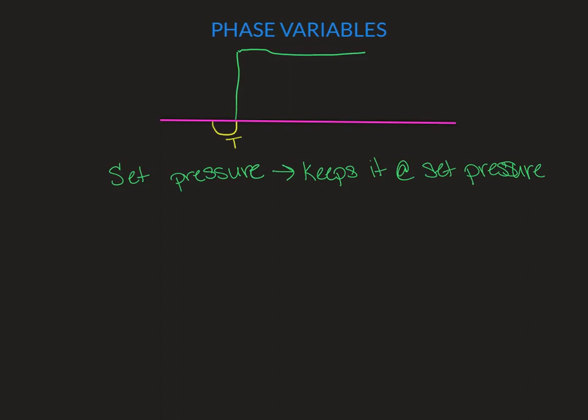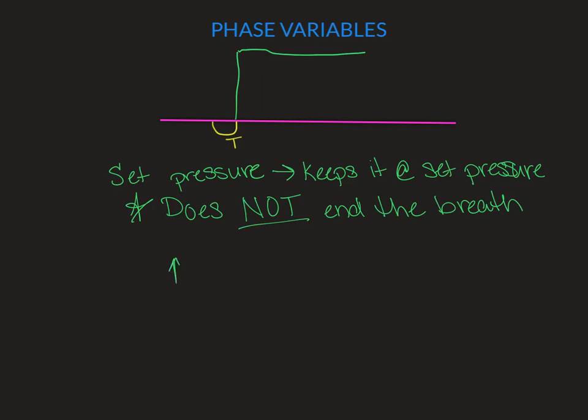It's really important to remember that the limit that you set does not end the breath. This limit is the pressure that we set, and it's going to hold this pressure throughout the whole patient's breath during their treatment.